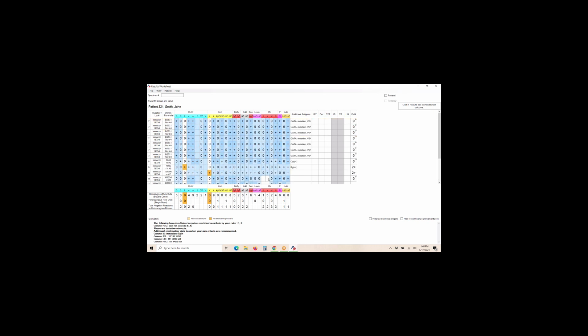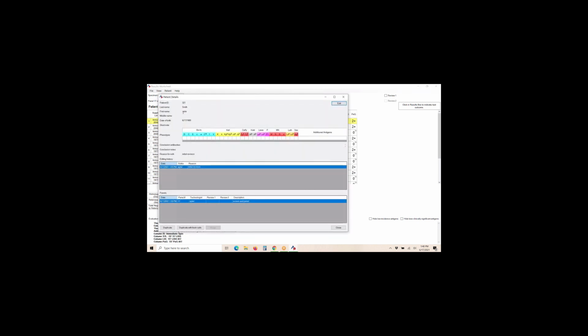And we have several negatives on the panel. So you've definitely met your rule of 3 for inclusion, more than that for the K, and actually more than that for the negatives for the E. So we're at a point now where we would want to antigen type our patient. And again, you don't have to do this in Antigen Plus. You don't have to do any of this electronic stuff, but we're just showing you everything you can do.